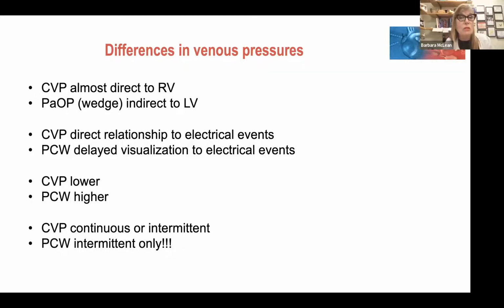This is serious business. And one of the reasons, depending on the units you work in and where you're working, is that if you work in CVICU here at Grady, nurses are never allowed to inflate the balloon. Maybe some nurses with special privileges, myself, maybe others, but in general, you never inflate the balloon to get a wedge pressure. In the SICU, they inflate the balloon all the time. So it just depends on who your attending doctors are.